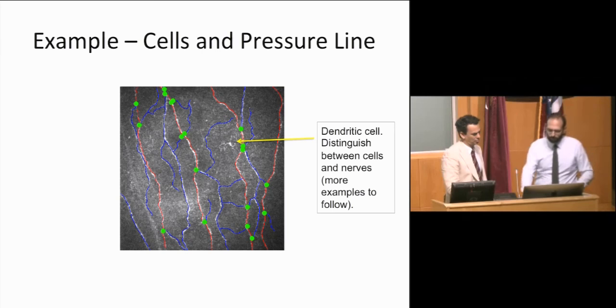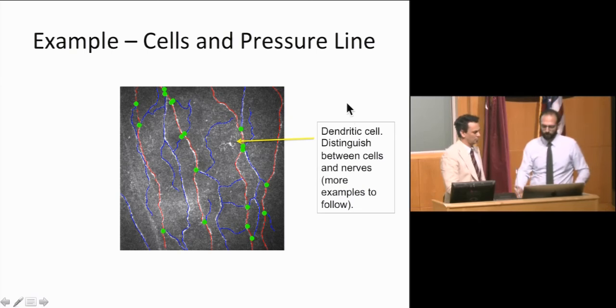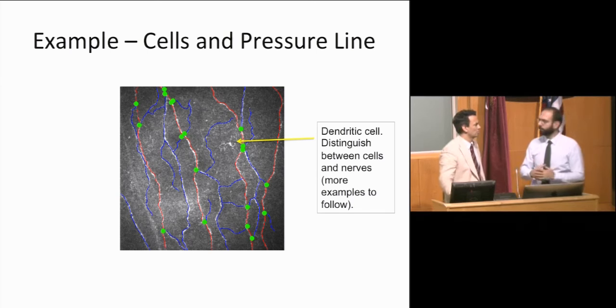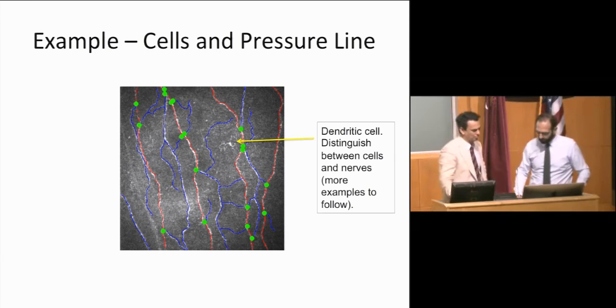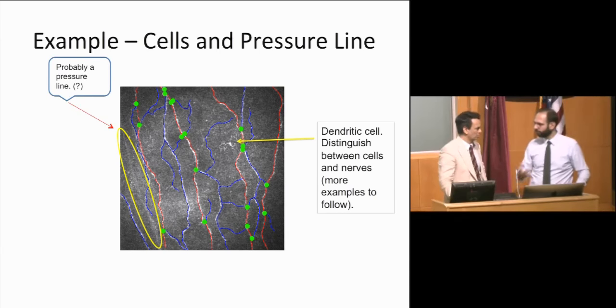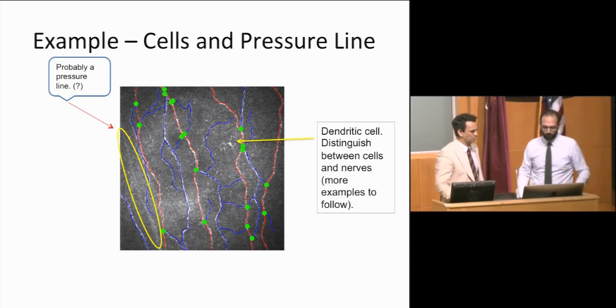So as I said, this is a cell and probably a dendrite. So you have to distinguish between these cells and the nerves. Otherwise, and as we're going to see in the following examples, it can lead to a significant overestimation of the number of nerve fibers or branches in the image. And always keep in mind that you might see pressure lines and you shouldn't be tracing these as nerve fibers. They haven't got any importance for the results.